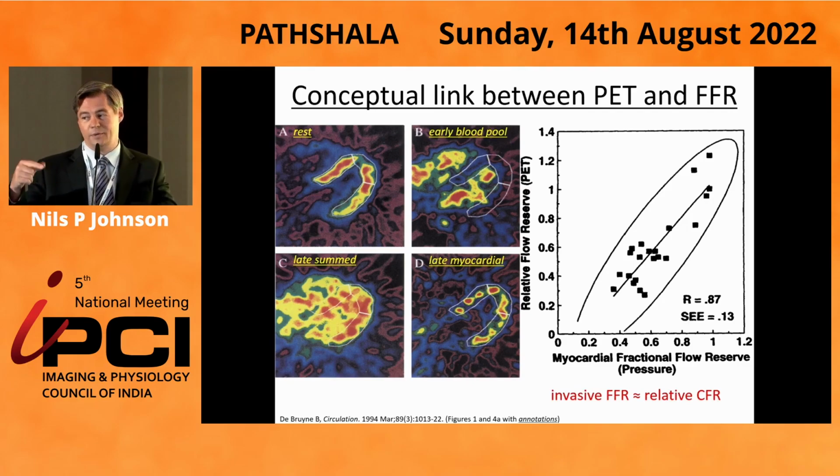And actually, what Bernard did for this is he got up early, he drove to the patient's house, picked them up, drove them over to one side of Brussels where they did the PET scan. They did the PET scan, got back in his car, drove them over to Aalst in Belgium, where he then put them on the table and made the FFR measurements. So every dot on this graph represents a car trip that Bernard made between Brussels and Aalst. That's where this data comes from.